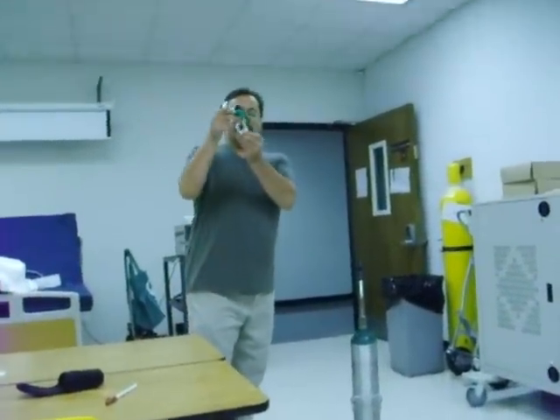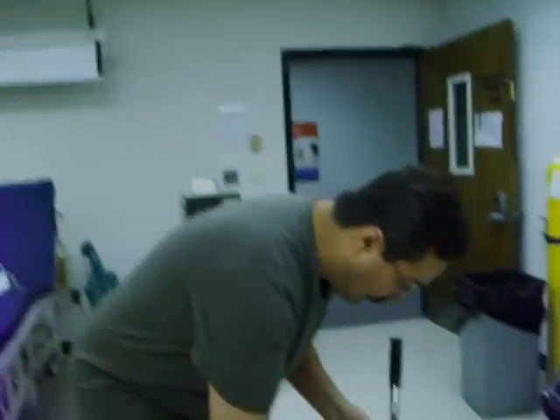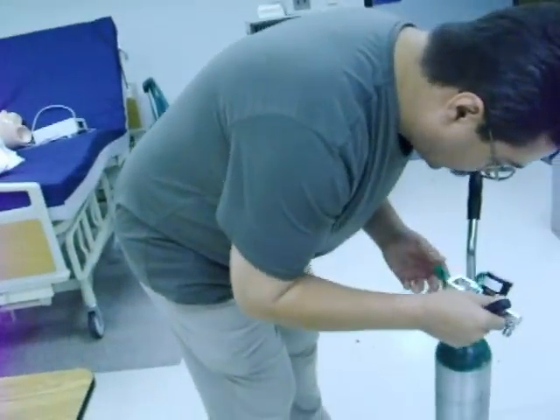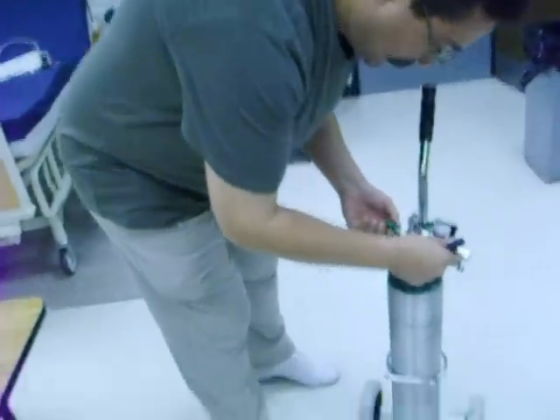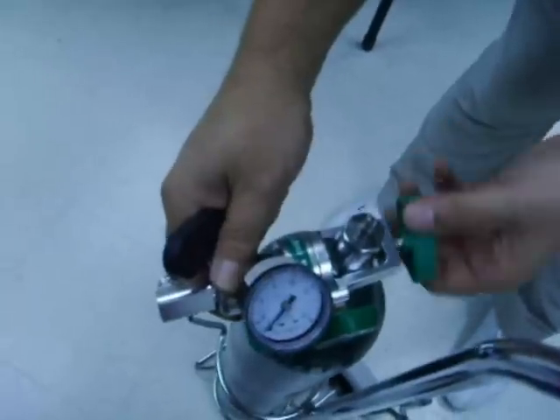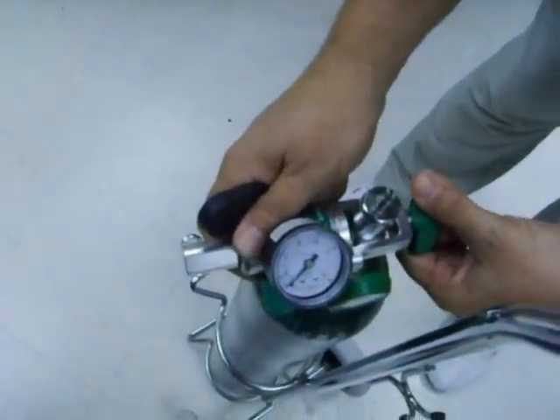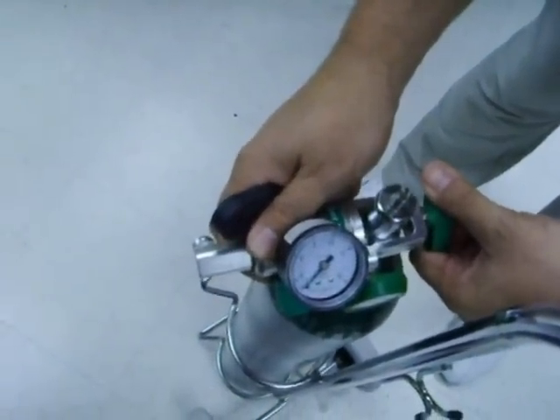Now we're going to take our PISS regulator — pin index safety system — which means the pins are at 2 and 5 for oxygen and will only fit in an oxygen tank. This is a new type, lightweight aluminum regulator. We ensure it has a gasket for a good seal, and we're going to hand-tighten the thumb screw.